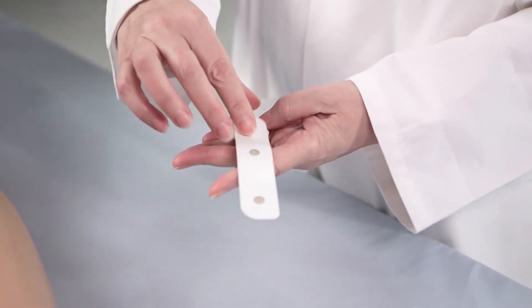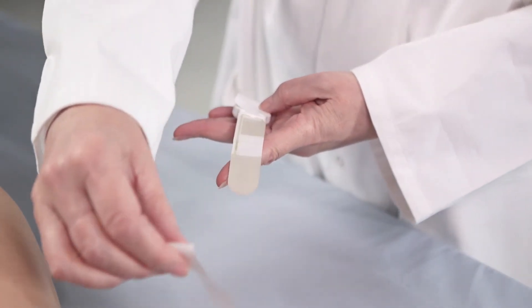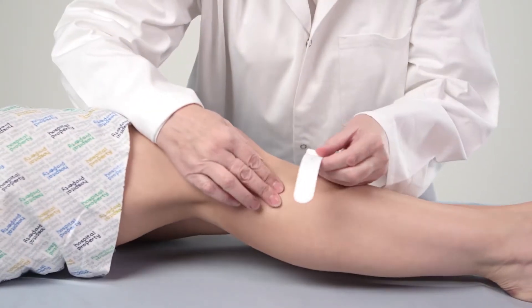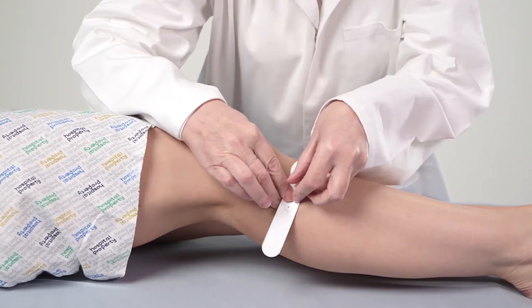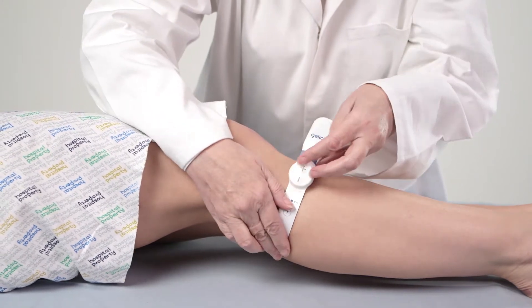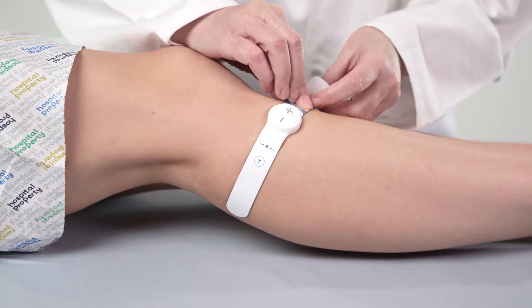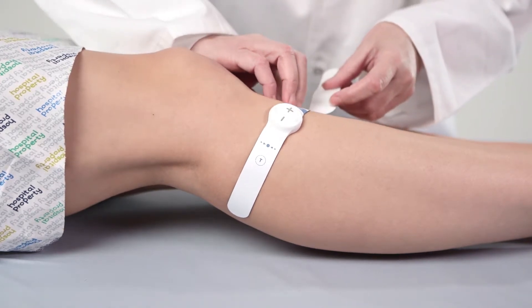After 15 seconds, with the device switched off, peel off the protective film from the long end first. Secure the device to the leg so that the location marker — the line of arrows — is positioned directly over the centre of the fibular head. Next, remove the protective film from the short end and secure this to the front of the leg.